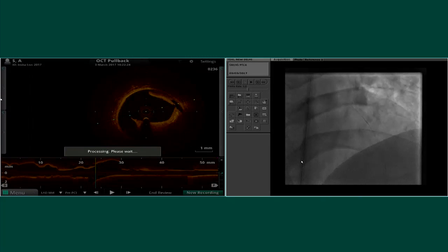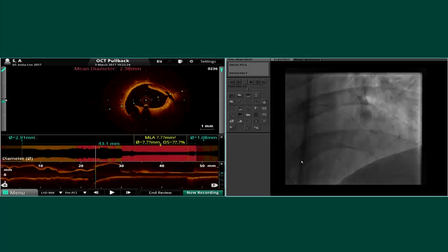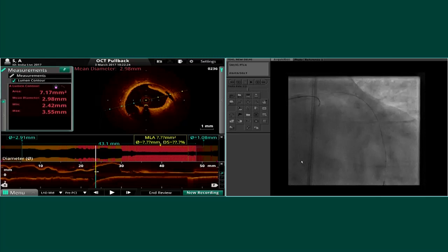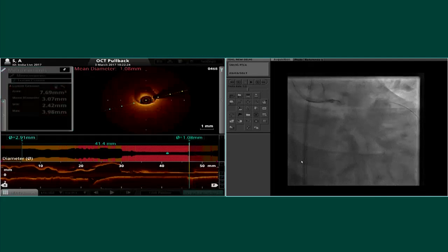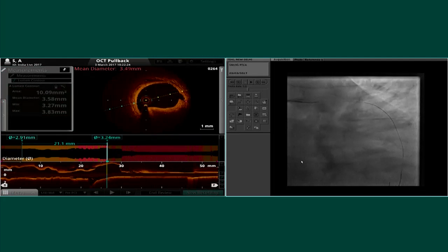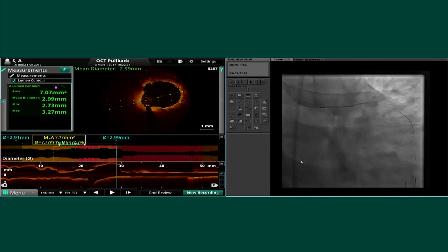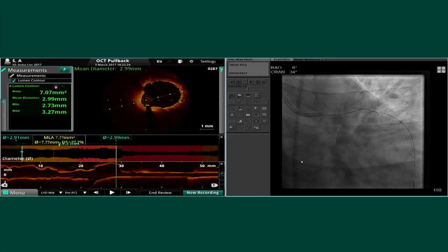Before this, we have to do the calibration first to be sure that the measurements are okay. And there's the lumen profile, which is helping us. You see the contours are a little bit in red because the automatic contours are more difficult at the location of the flush and the location of the dissections. But you can see the distal landing zone. I think there the contours are okay.